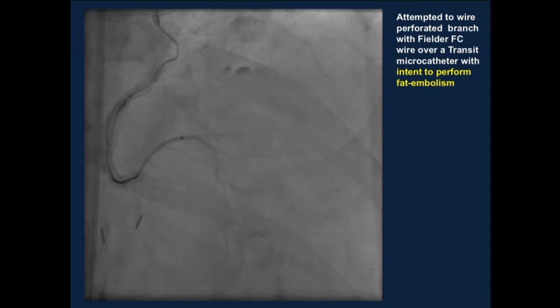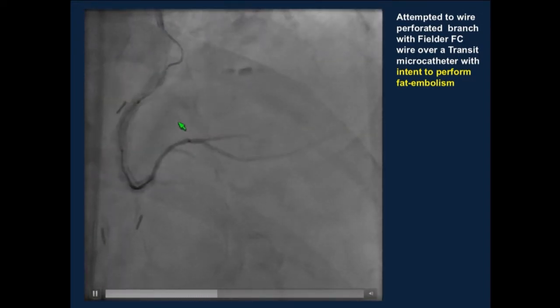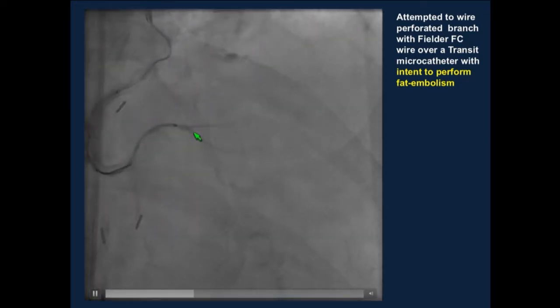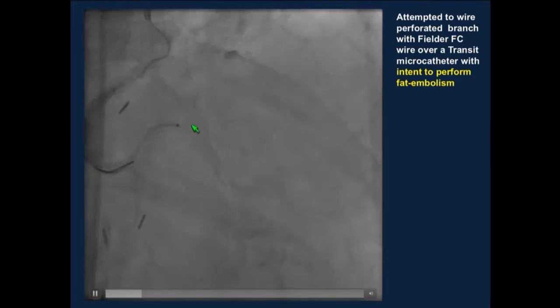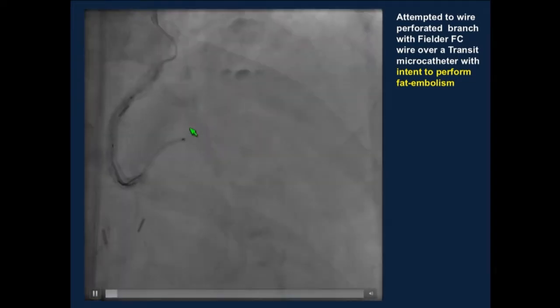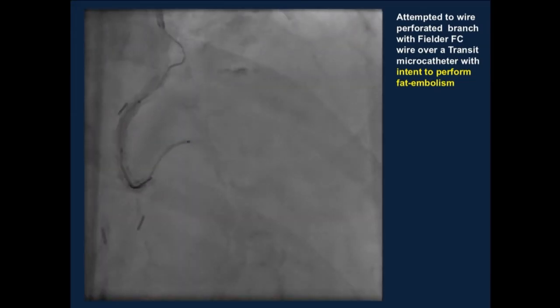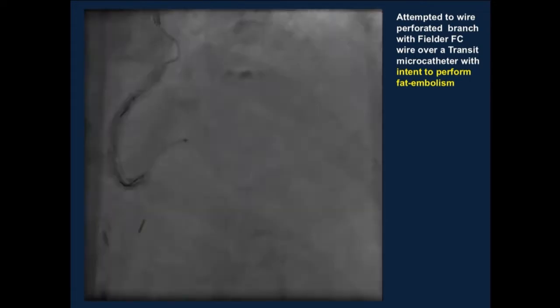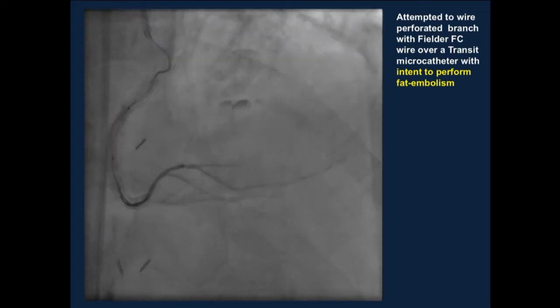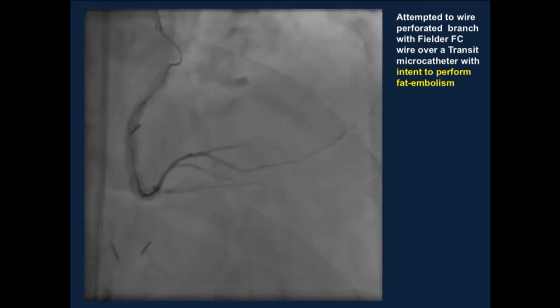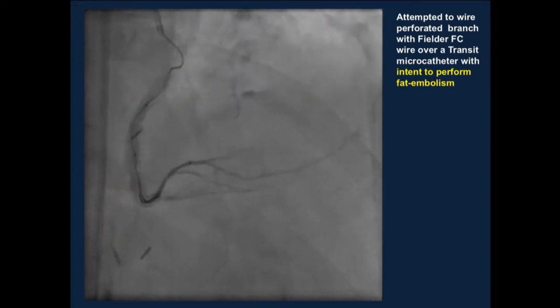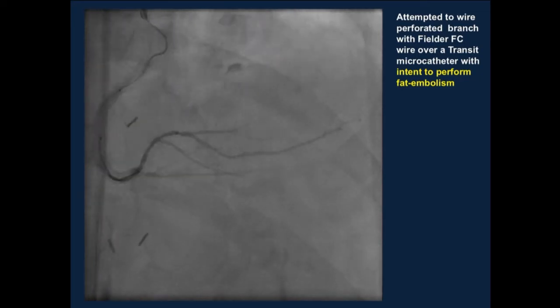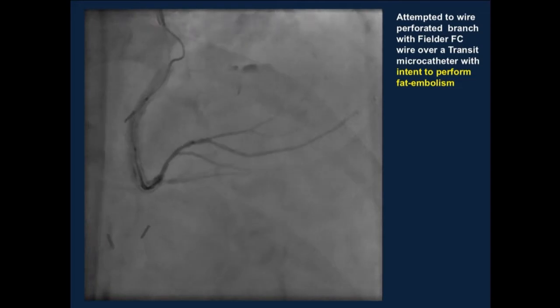We advanced a transit microcatheter. This is the vessel where the wire went distally and caused the perforation. The challenge was how to wire this tiny branch in order to perform fat embolization — our initial approach. We took a little fat from the access site, mixed it with contrast, and loaded it into the transit microcatheter. The idea was that if you could place the microcatheter into the branch, you could embolize and occlude the site of perforation. However, we were unable to do this despite numerous attempts at wiring that tiny branch.